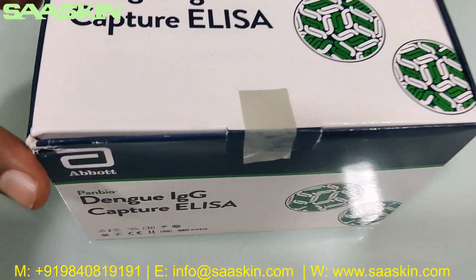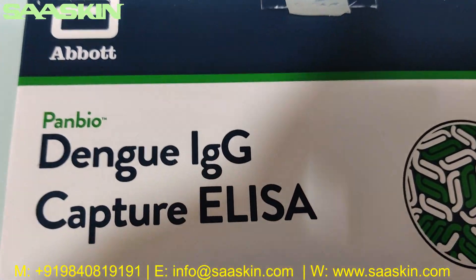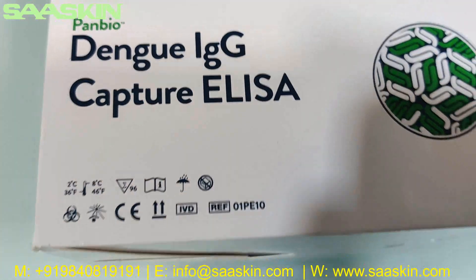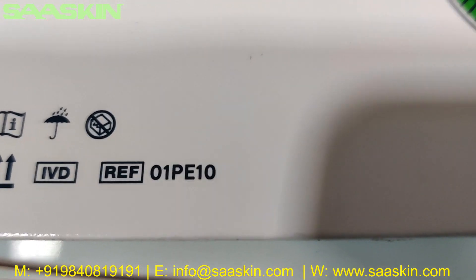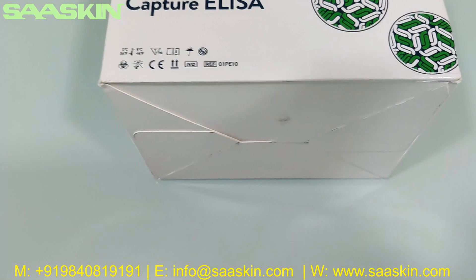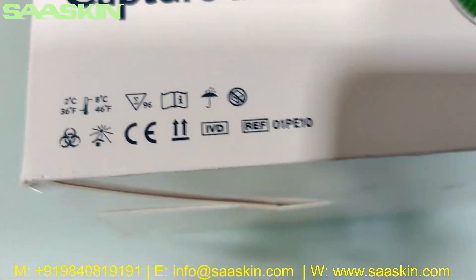This is from the Abbott brand, the Panbio one. You can see Abbott Panbio Dengue IgG Capture ELISA. You can see it is a CE certified product and you can see the reference part number for this kit. You can also see the temperature range — it has to be maintained between 2 to 8 degrees Celsius.